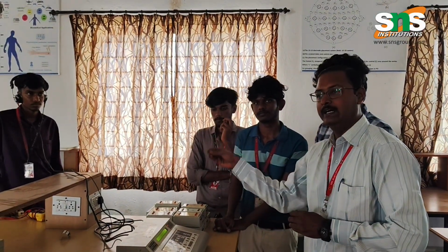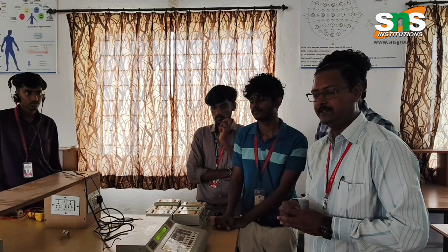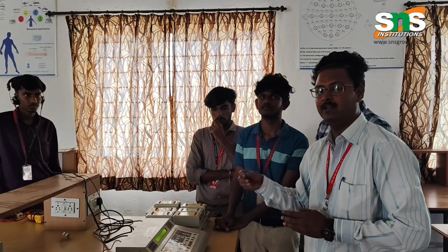I hope this demonstration and case study have given you a small insight on how to use this audiometer for getting the response of the patient, to understand whether he is normal or abnormal in hearing.